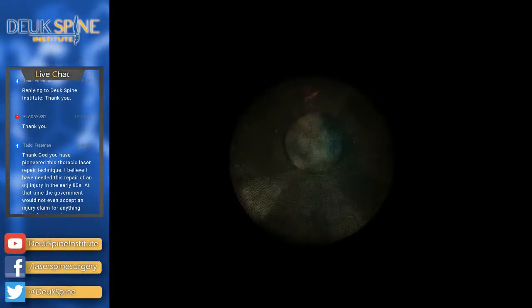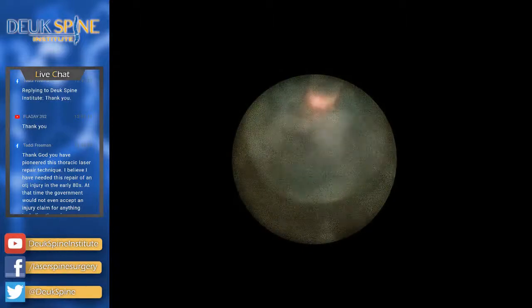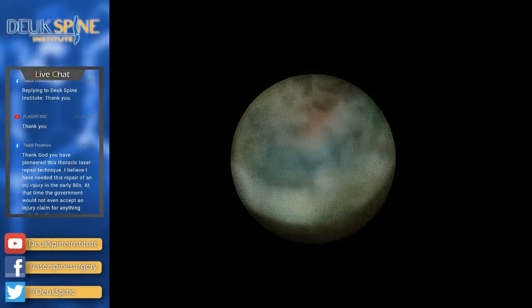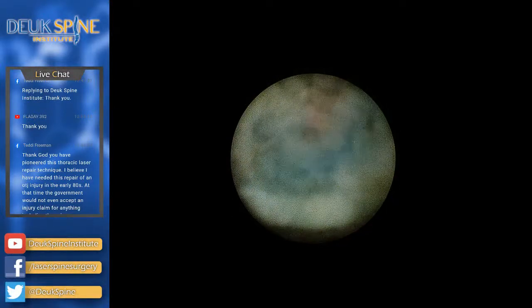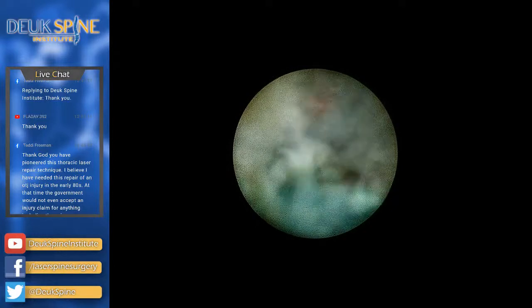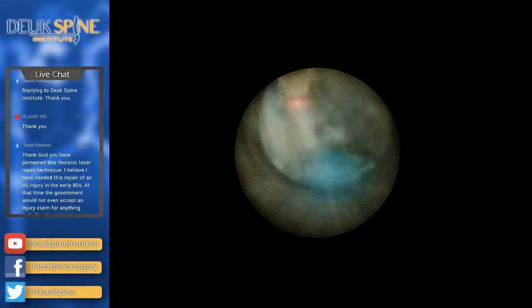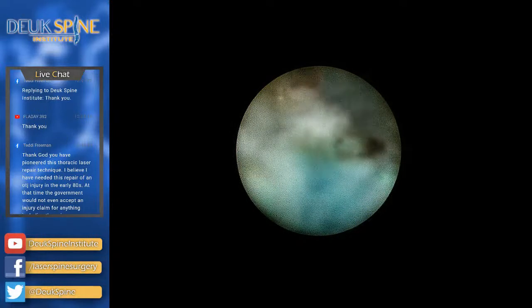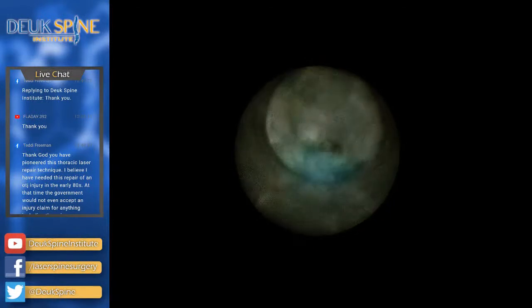So I am in the process right now of removing the herniated material, which is the blue stuff, but also cleaning up the tear so that it will heal on its own. I can't heal tissues. Surgeons can't heal tissues. Only the body can heal tissues, the human body. So this patient needs to heal this injury himself. But I can help his body heal by removing the foreign body, which is the herniation. That herniated disc is the foreign body that's preventing his own body from being able to heal this problem on its own. That makes sense? So I'm just helping him do what his body wants to do on its own.